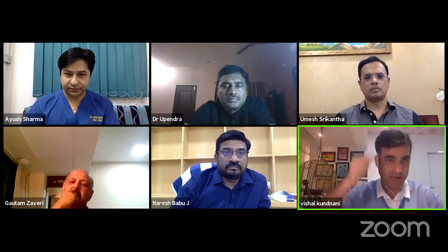Right. And maybe most of the time you might be able to get a bicortical hold, and that will give you a really strong fixation. Also, Ayush, we were discussing a problem called dorsal burst out. Say you are doing a C3 to C6 or C3 to C7 fixation in a patient with laminectomy and lateral mass fixation. What do you do as a salvage if your C4 or C5 lateral mass gets burst out? Do you leave them and just finish C3 to C6? That's question number one. And question number two, what do you do if your endpoint anchors burst out? If your C3 bursts out and the last C7 bursts out, do you do a pedicle screw? Do you do wiring? What are your salvage options in those situations?